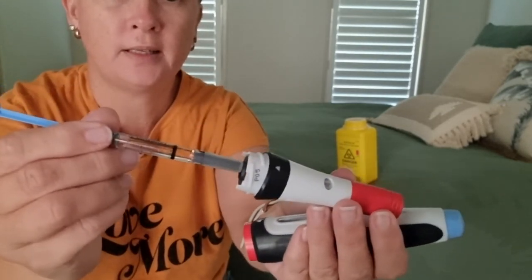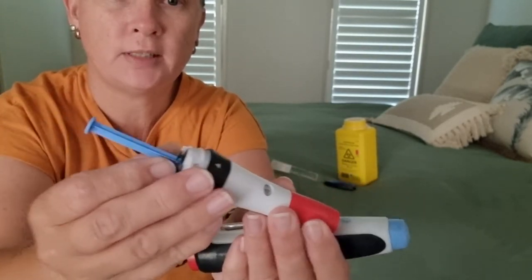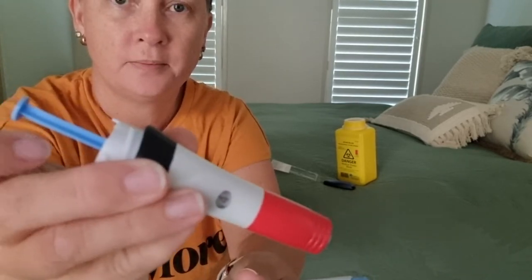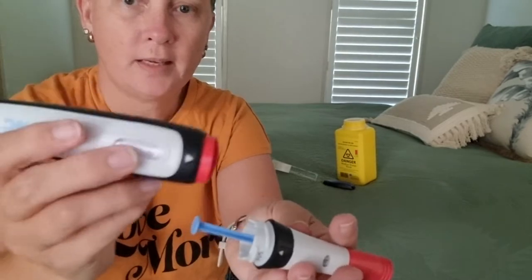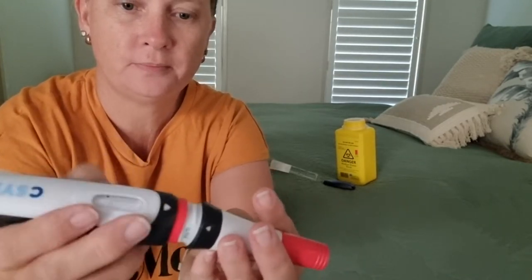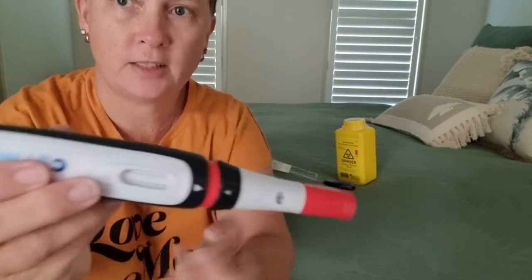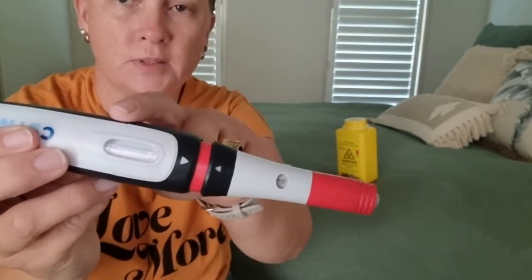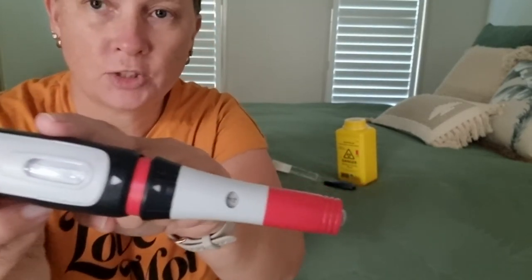We're going to load the needle into the auto injector until you hear it click — done. Then we're going to screw that back on. It's loaded and ready to go. Remember, this is white.